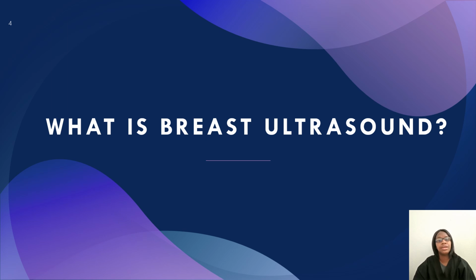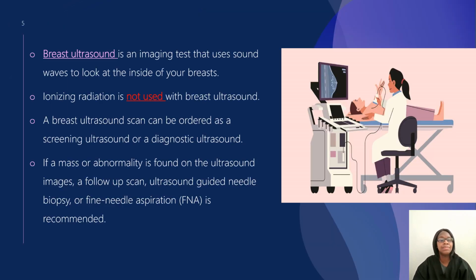So if you do not know what a breast ultrasound is, I will tell you in this section. Breast ultrasound is an imaging test that is going to use sound waves to get the image of the inside of a patient's breast. It does not use any form of radiation. And a breast ultrasound scan can be ordered as a screening ultrasound or a diagnostic ultrasound.